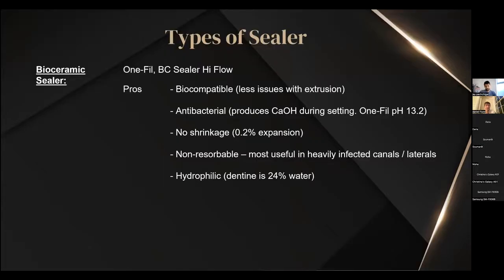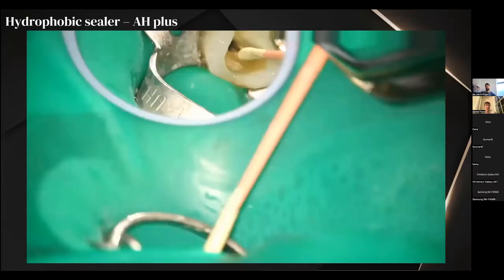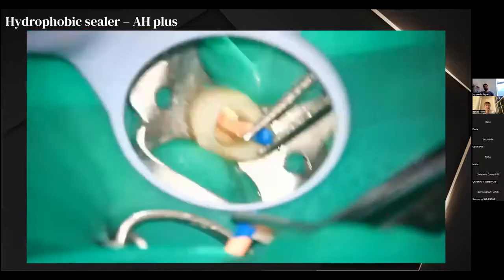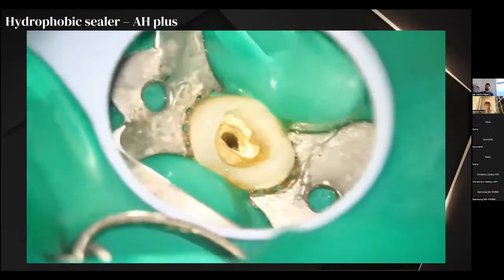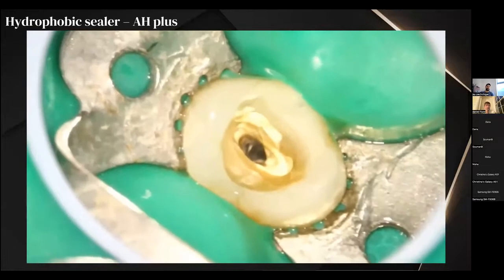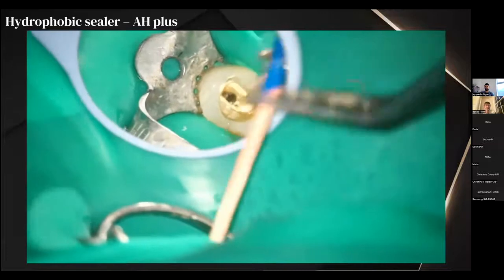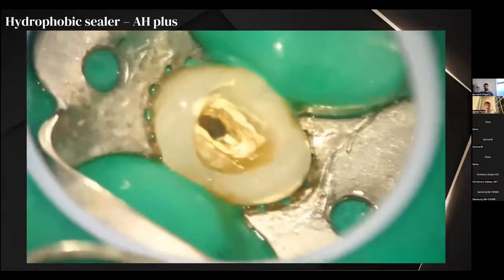So these bioceramic sealers are hydrophilic, whereas the resin-based sealers are hydrophobic. Dentine is about 24% water by weight. To be honest, I really only noticed this when I started using a microscope. I wouldn't say this happens every time, but it definitely does happen sometimes, where if you just place that cone into the canal, you're not likely to get a lot of sealer into the actual tooth. It does take a bit of effort sometimes to get your resin-based sealers into the canals.